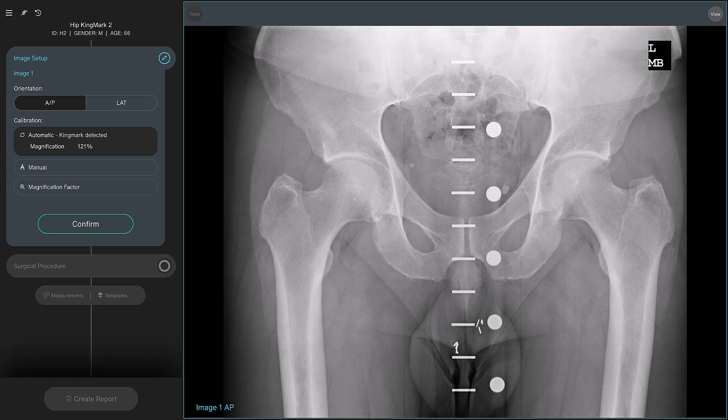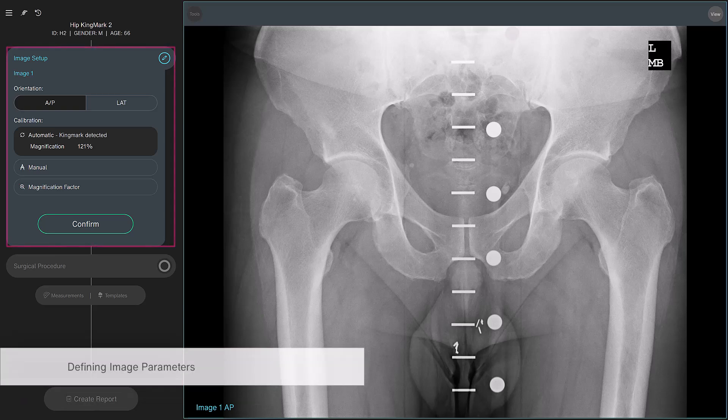The software walks you through the different steps of a planning workflow via the cards on the left. The first step in planning the surgical procedure is to define the image parameters.